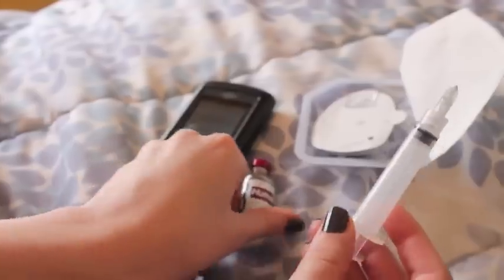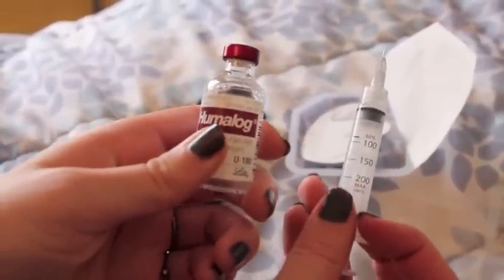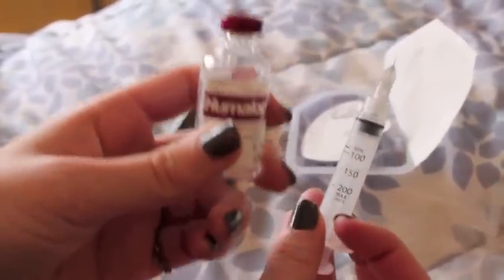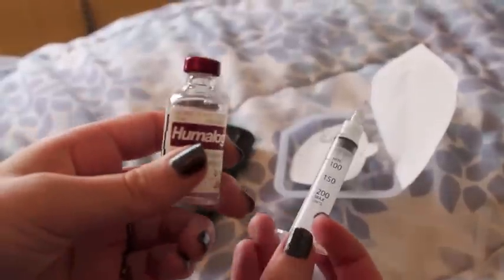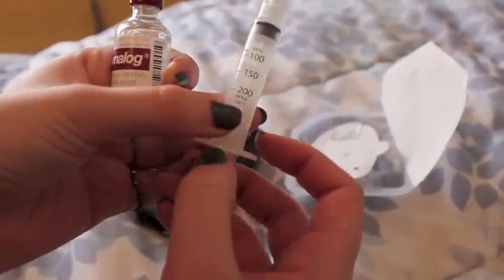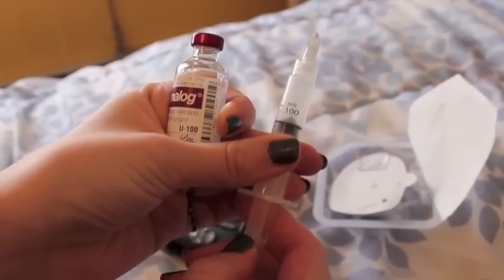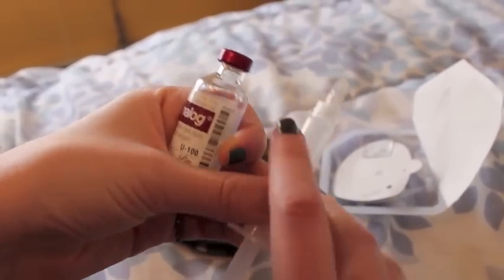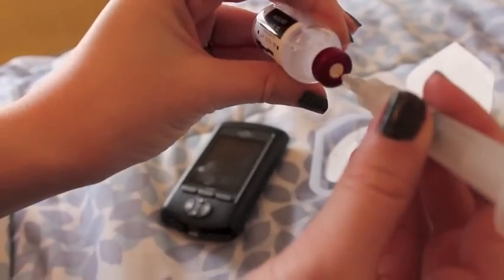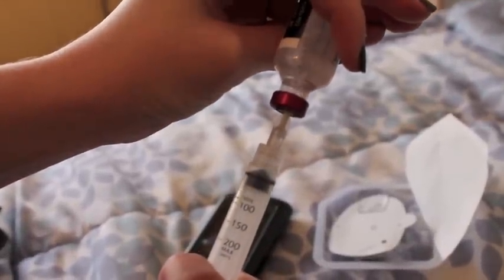Now, it's completely up to you how much insulin you want to put into your Omnipod, because everybody has different amounts that they're going to use over a 3-day period of time. So I usually put in about 125 units. So that's how much I'm going to do. So you're going to put in the amount of air that you need, and inject that in there.